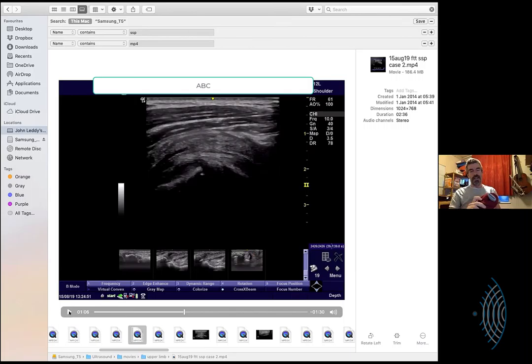One of the things I get my students to do at some stage when I'm teaching them, and the slower ones I do it often, is I get a much longer piece of couch roll like that, and I put it round the probe and I twizzle it round. This doesn't show it very well, but basically I get a strap like that and I put the probe on the patient's shoulder where the greater tuberosity is, and put this on the end of where the supraspinatus goes, where the actual muscle belly has its origin. And I just put it on like that. And I don't look at the screen. And I show them a perfect picture of supraspinatus.